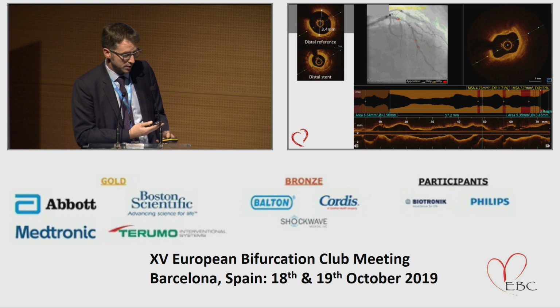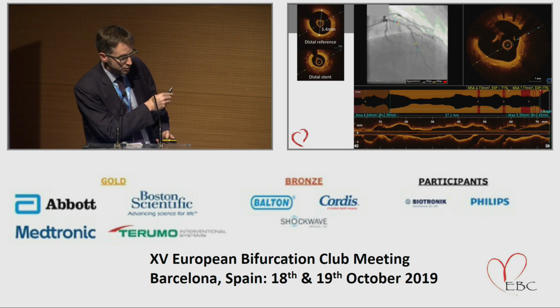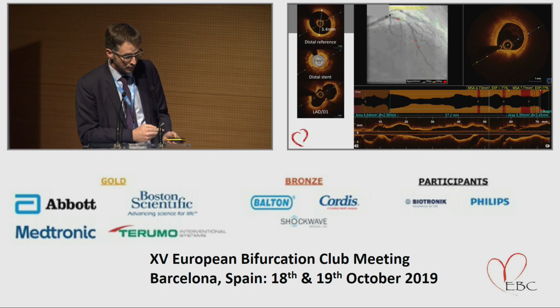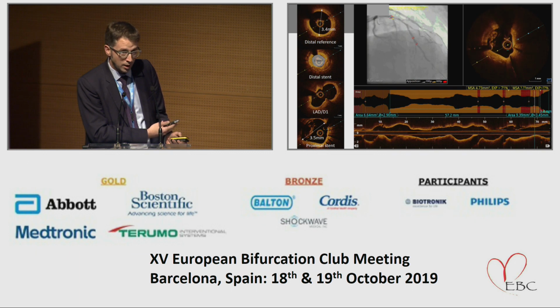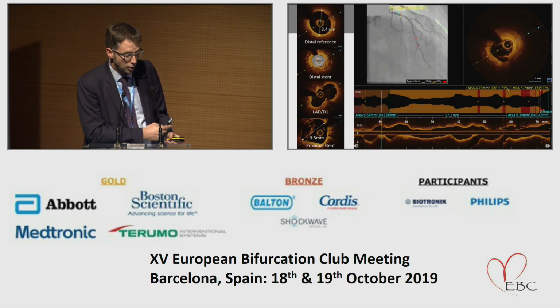The most worrisome aspect for me was the really aggressive neoatherosclerosis, particularly in the Taxus stent, where we see a very marked ring of calcium intra-stent. The mode of failure, I think, in measuring this stent was that it was a significantly undersized, underexpanded stent in the mid-vessel of the LAD with an MLA of 1.9. And in fact, the diagonal bifurcation looks relatively free of disease. Upstream, we can't comment on the adventitial element, the external elastic membrane, but the luminal contour of the proximal stented LAD segment is 3.5.